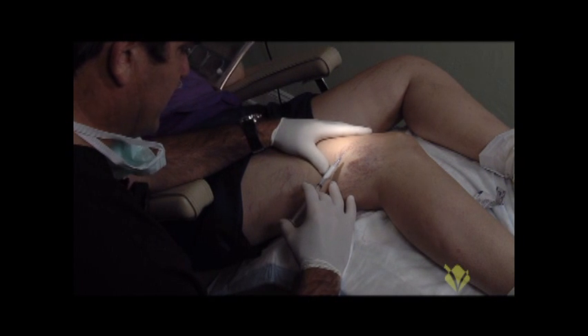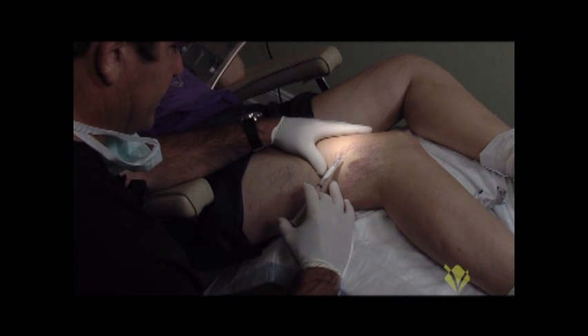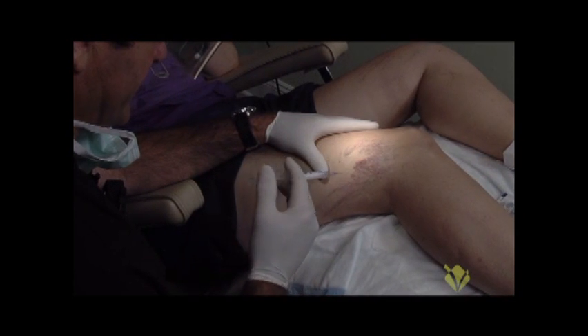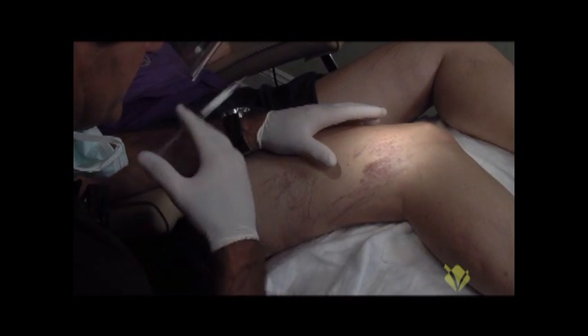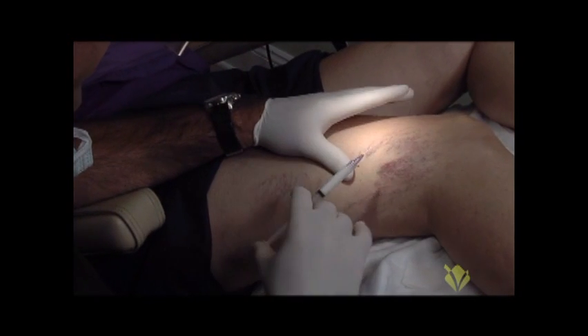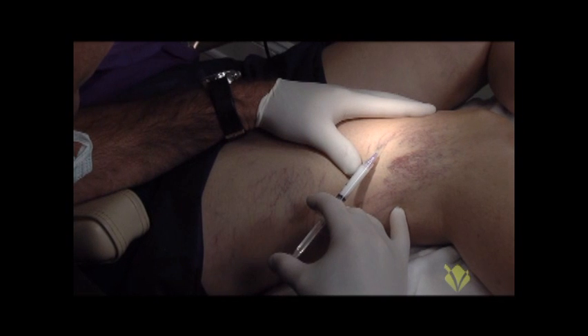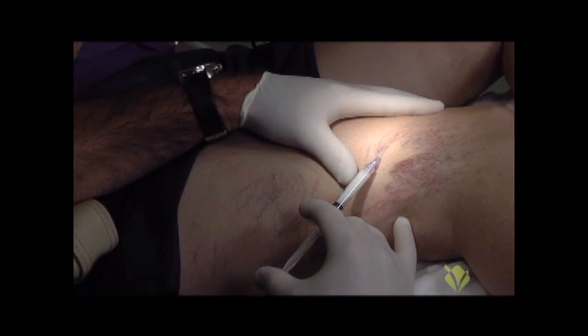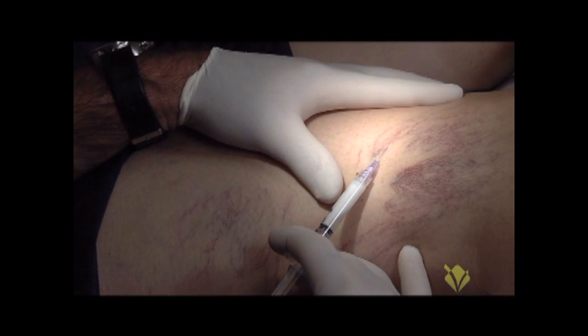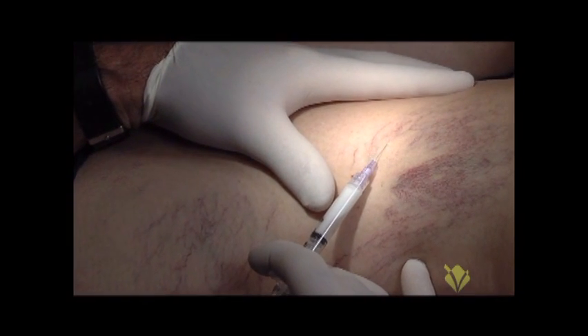Use gentle pressure when you insert the medicine and inject just enough to clear the veins you're treating, as opposed to a lot of medicine. I'm keeping the foamy solution in solution. Now I've stretched the skin, I have the bevel of the needle up, I insert it, and then I'll start injecting.